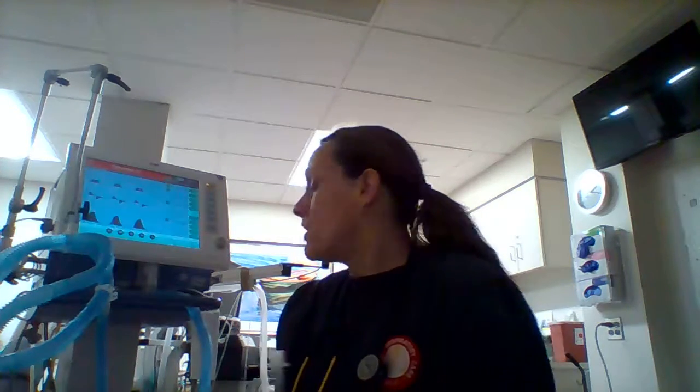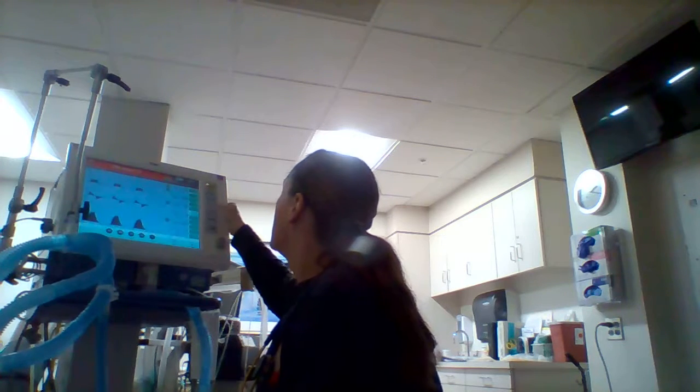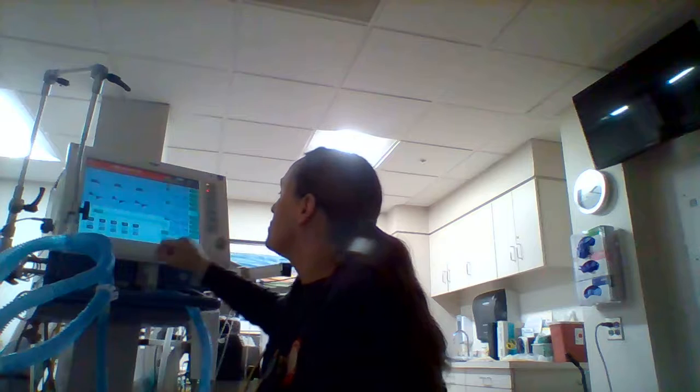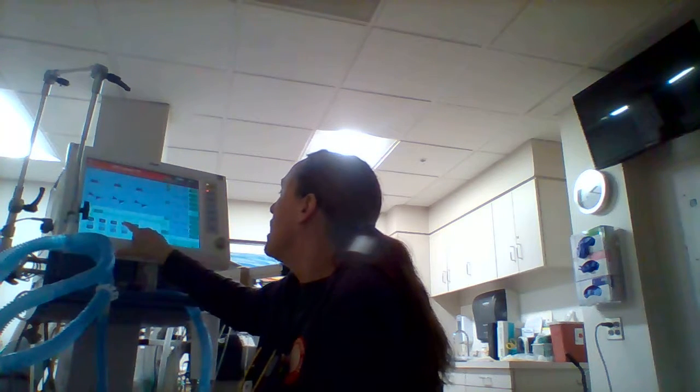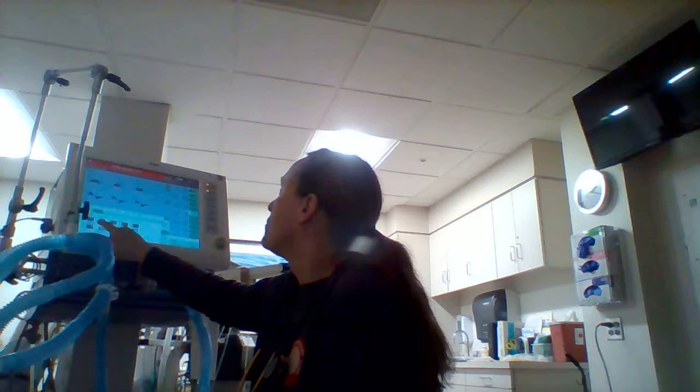Cool. Alrighty. So we would document all of our settings and alarms, which I don't think I set the alarm. I forgot, which is okay. It kind of remembers the last alarm setting. So we have high respiratory rate of 35, peak airway pressure 40, minute ventilation 10.